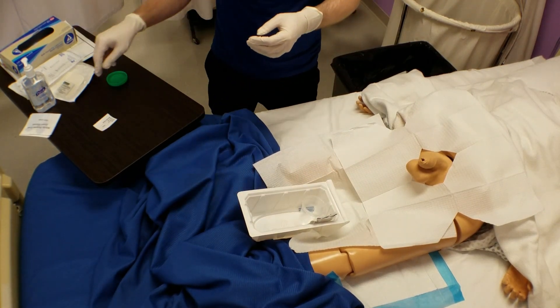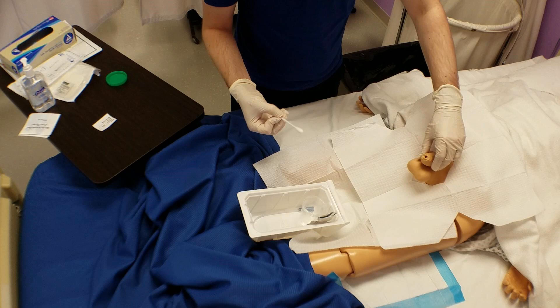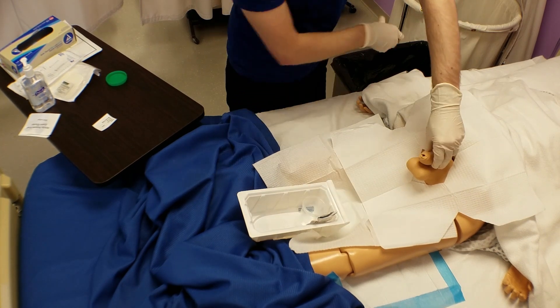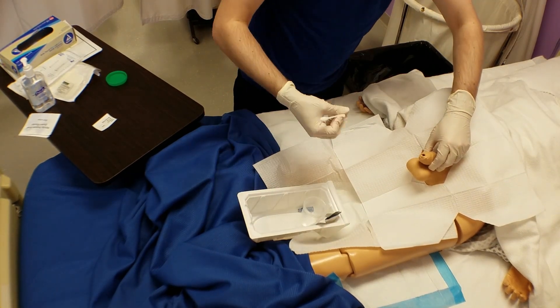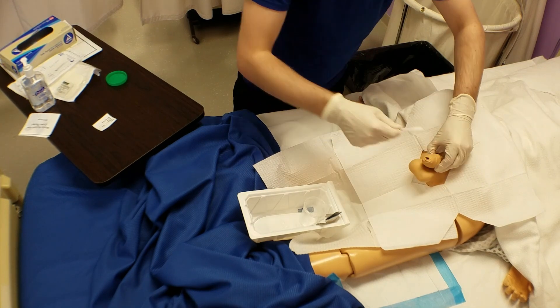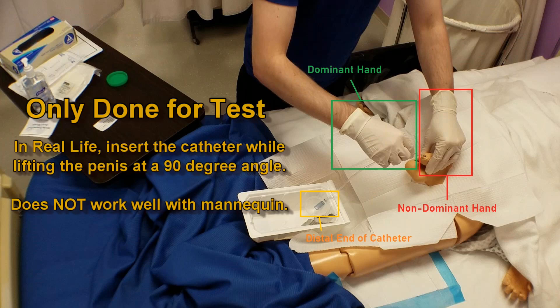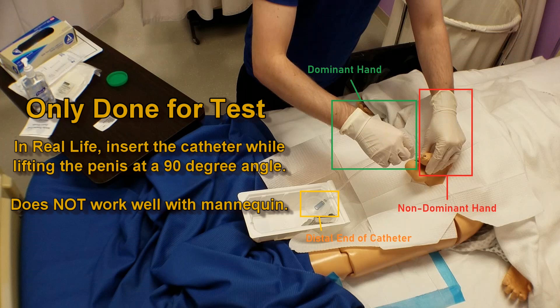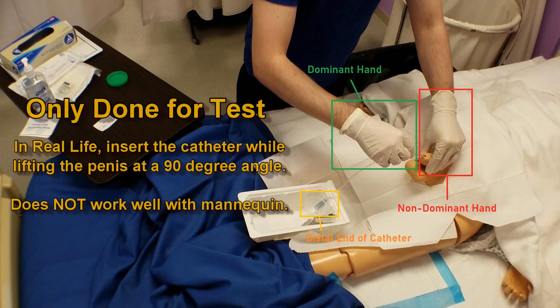Once you have double-checked that you and your patient are ready, use your non-dominant hand to grab the penis. Verbalize that you would retract the foreskin if the patient were not circumcised. Pick up one of the sterile swab sticks with your dominant hand and cleanse the penis by swabbing in concentric circles outward from the urethra towards the base of the glans. Repeat this motion two more times using the remaining swab sticks. Pick up the catheter and ensure that the distal end is directed into the basin. In real life, lift the penis upward with light traction so it is perpendicular to the body — on the mannequin, simply verbalize this, as that technique will kink the urethral passage.